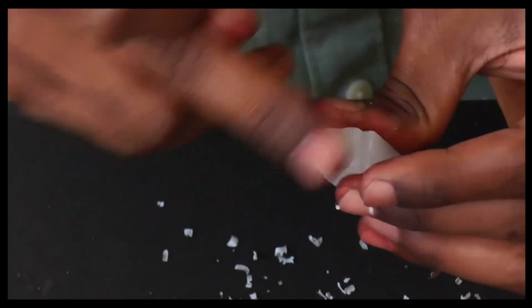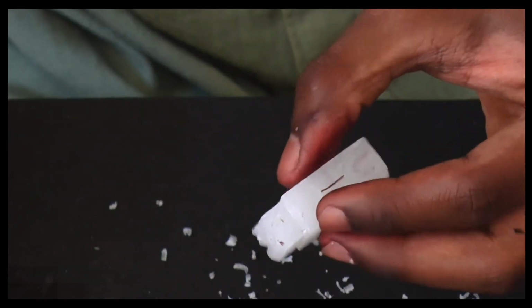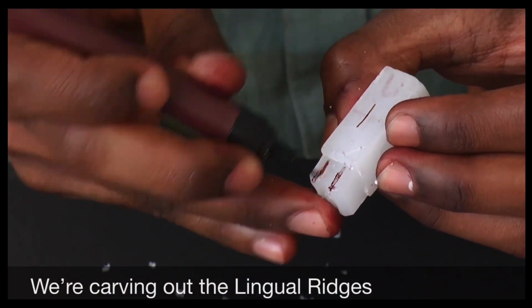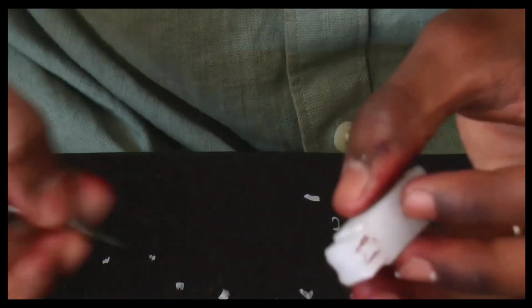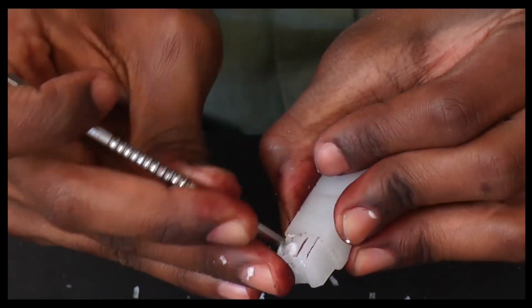Okay, now having carved all the cusps, we'll do the same thing which we did for the maxillary molar, which was to give the ridges on the sides. So there are many ridges here. These are all the ridges. And we start with the biggest cusp. We give it a nice ridge.